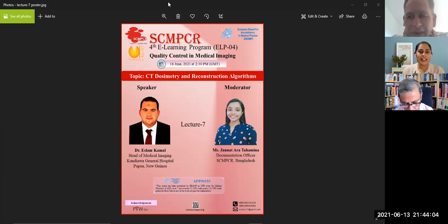Yes, sir. Thank you. I also have one more question. When you say physics mode in interventional radiology, is it the same as the service mode? No, it isn't. The service mode is usually there, but you do not get access, because the vendors do not like physicists to fool around in the service mode. That's why I recommend talking to the vendors if they could give you something.